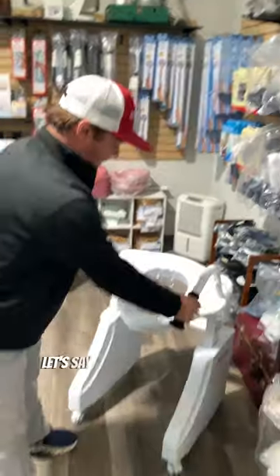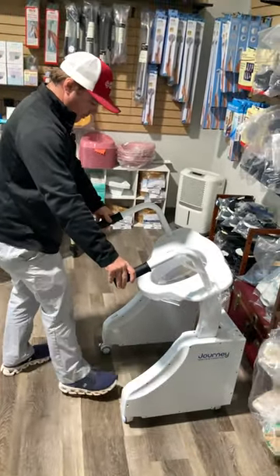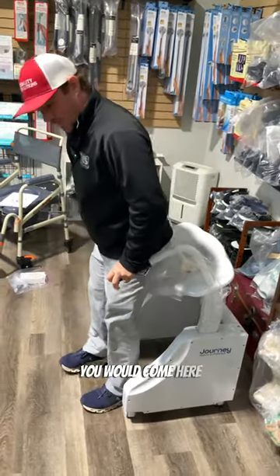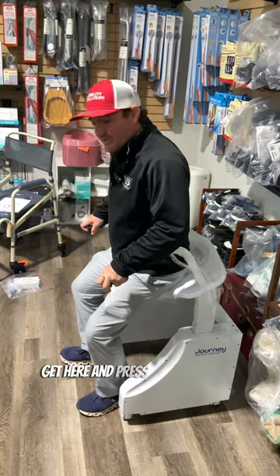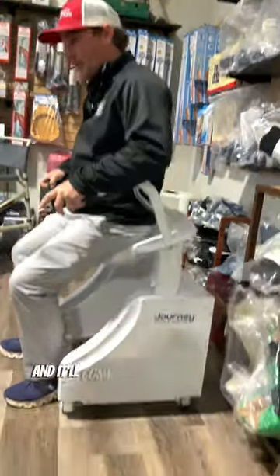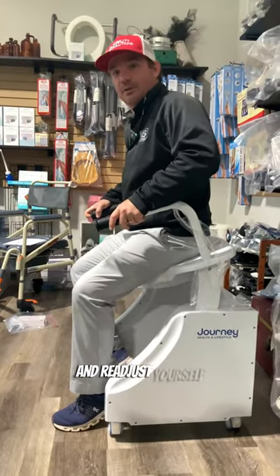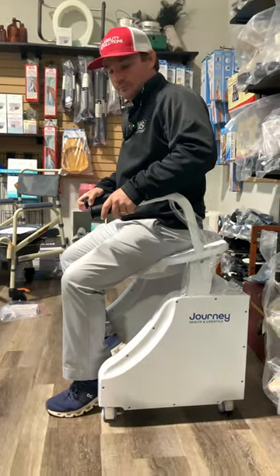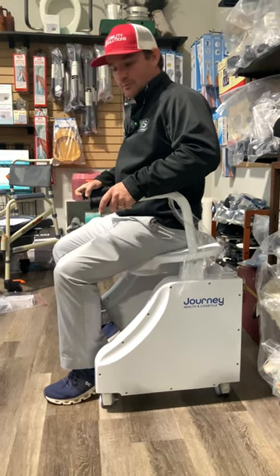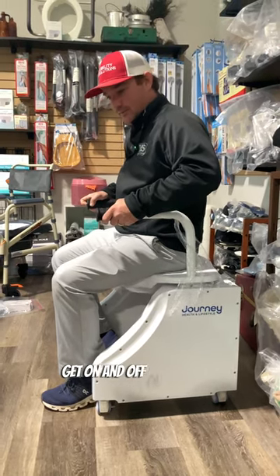Let's say someone is getting onto the toilet. You would come here, press the rocker button the other way, and it'll come down. You can stop and readjust yourself. And that's how you can safely get on and off of the toilet.